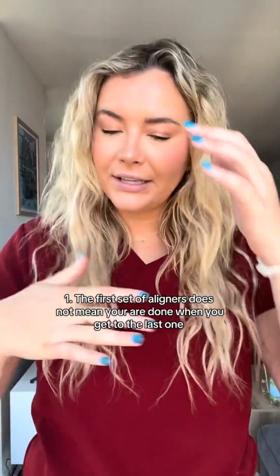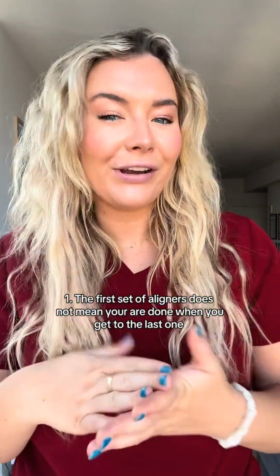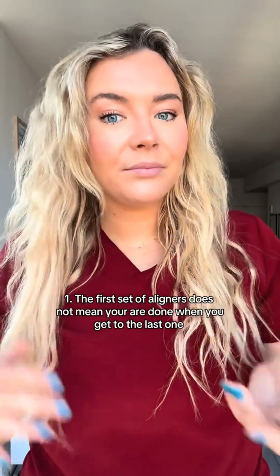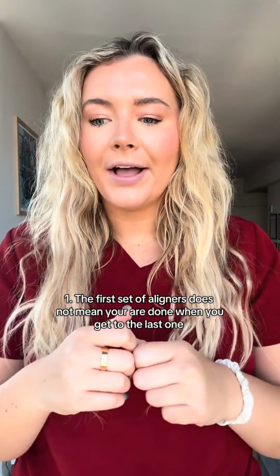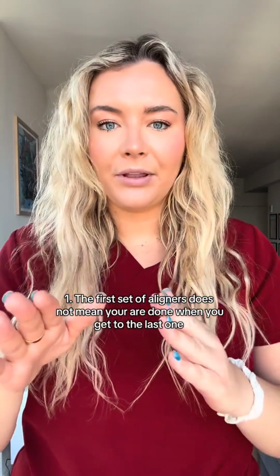Usually at the end of 20, you're going to need another round of aligners. So if your orthodontist gives you a set of aligners and you think, oh, I'm going to be done in 20 weeks if you're changing them every week, that's usually not accurate. Usually something will need to be fixed or tweaked. Not all the time, but usually. Usually that's because orthodontists are very nitpicky and they'll see like one little thing they want to try to fix. So I just want you to know that, because I feel like sometimes my patients, even when I prep them, it can be a little confusing.